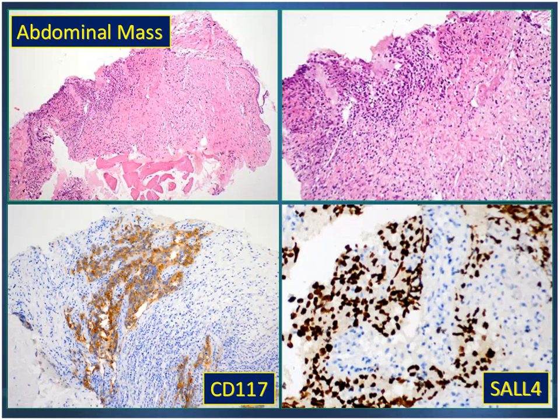As you know, CD117 or KIT is also a marker for germinomas in general, seminomas and dysgerminomas, which are keratin negative. They're also PLAP positive and D240 positive, but SALL4 positivity of the nuclei, as you can see in the right lower corner, identified them as actually tumors of germinoma origin.